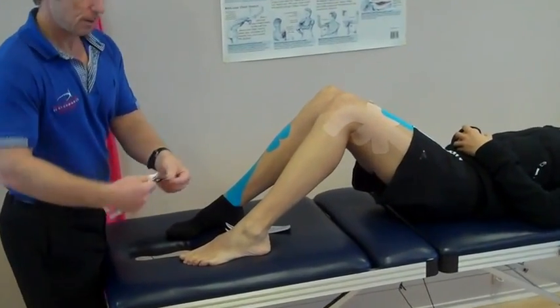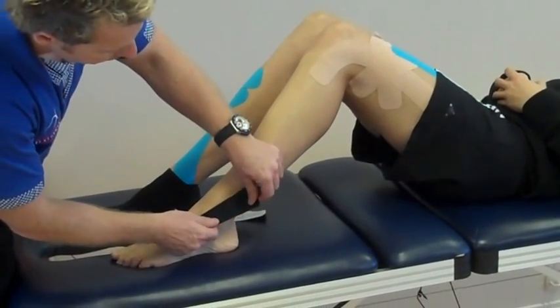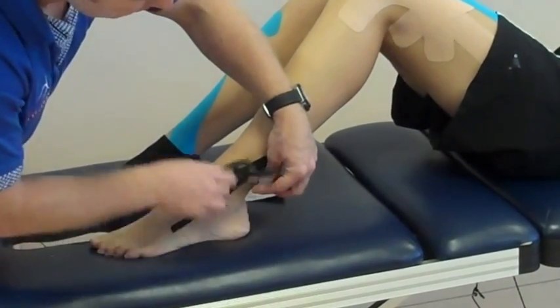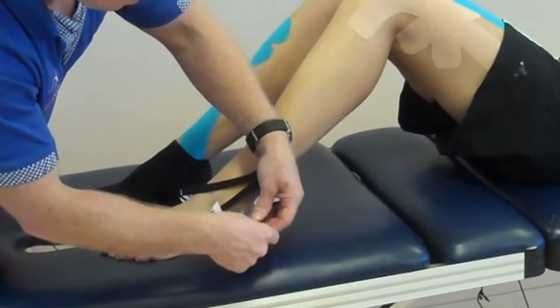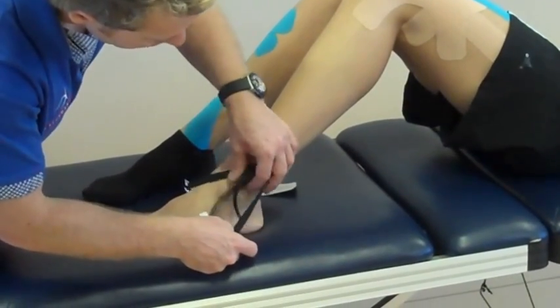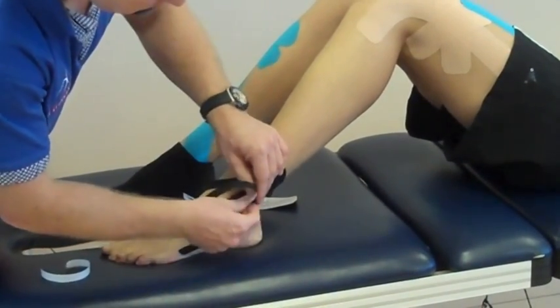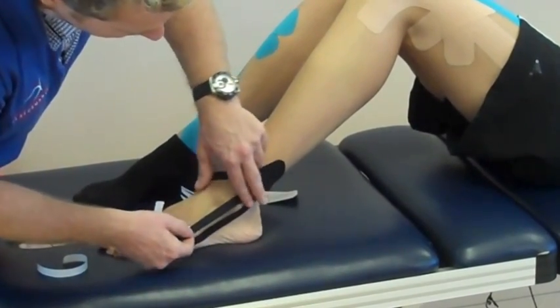So using the first strip, split the tape and then place the first bit slightly lateral. Then what we're going to do with the four legs is just peel one back, sometimes again away a little bit, as you can see. So from there, you're going to literally feed that one around, like so, and then the second one, just peel that back and just lay that one down.